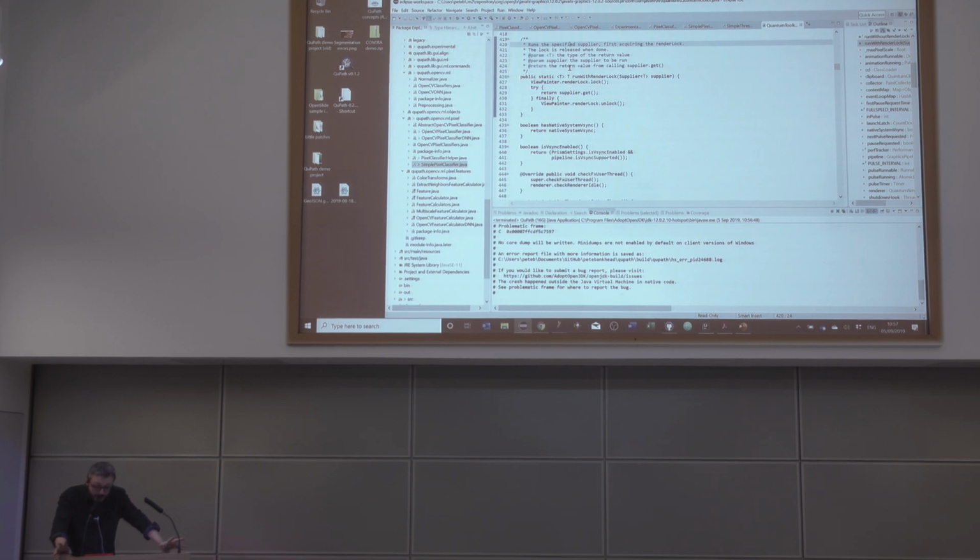But I've implemented it in such a way that you could also use something totally different. Lots of this is defined with interfaces, in the idea that somebody might want to come up with an extension to QuPath that integrates with something very precisely. And actually, I would like to do that myself, because I think that the OpenCV one has some limitations. Crashing catastrophically is one of them, but I can't say that's their fault and not mine.